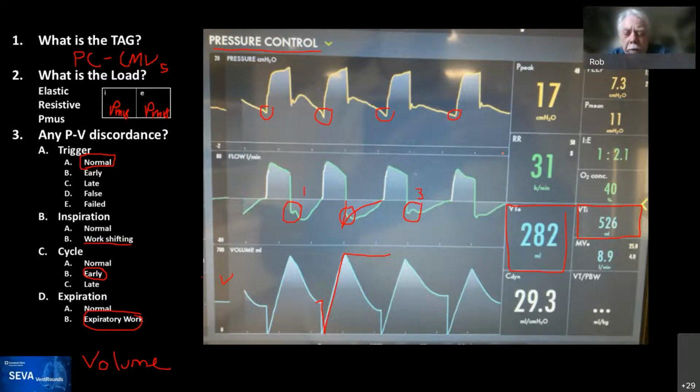And that leads you to a discussion of the automatic cuff pressure regulators, which in fact are sold with the Hamilton ventilators, and you can buy them as standalone as well. Those cuff pressure regulators only adjust the average pressure. They don't get away from those peak pressures during inflation. So it may cause harm if you're increasing pressure during inspiration, or as you say, you might need it just to keep the tidal volume delivered. Absolutely. And there are other types of leaks in which you may have a bronchopleural fistula, or as they call it, alveolar pleural fistula, in which the leak will be constant.